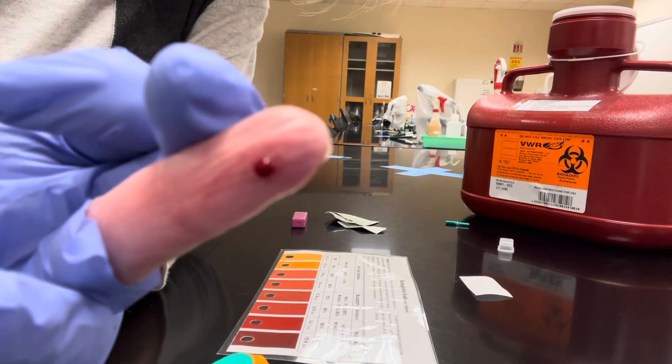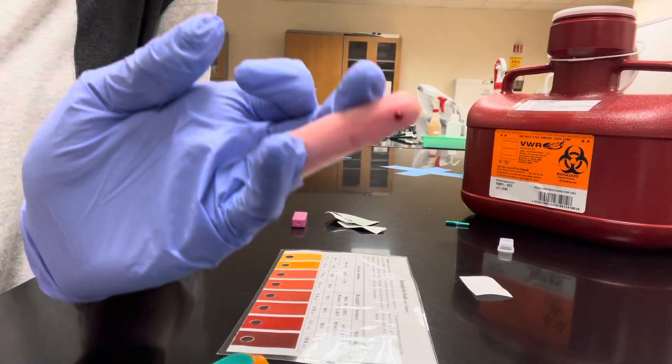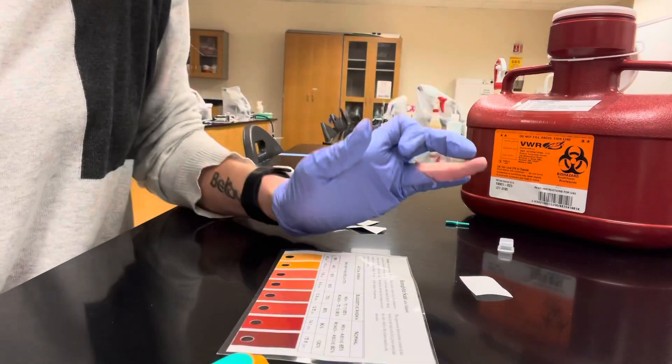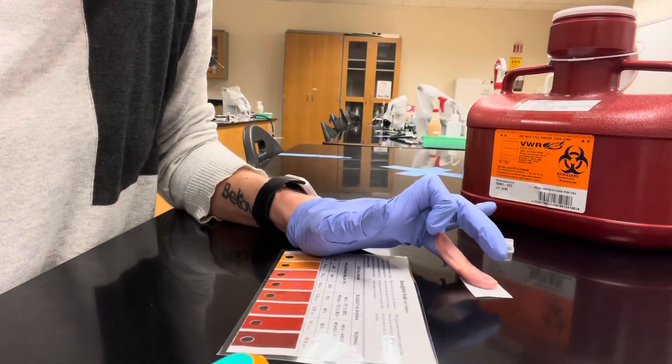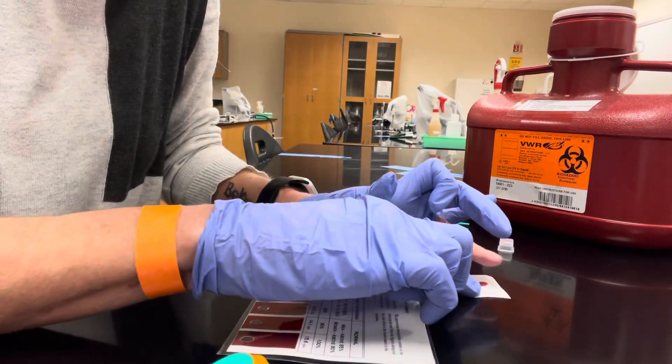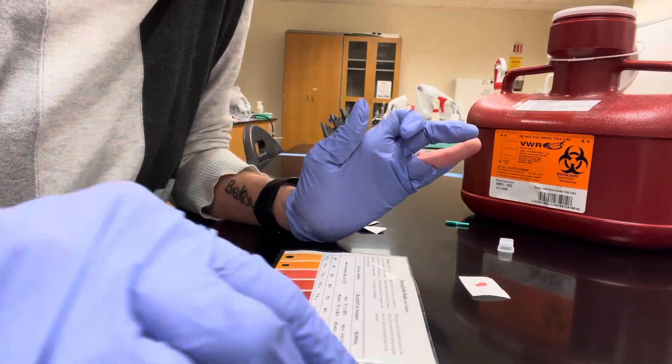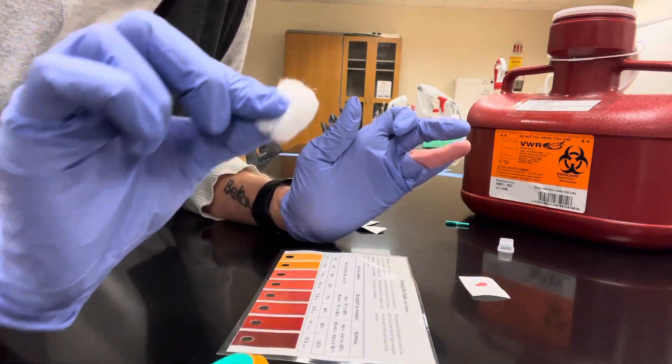Once you have a decent sized drop of blood, you just take your finger and touch it to the Talqvist paper. It might be a little sticky. Go ahead and tend to your wound while it's drying.